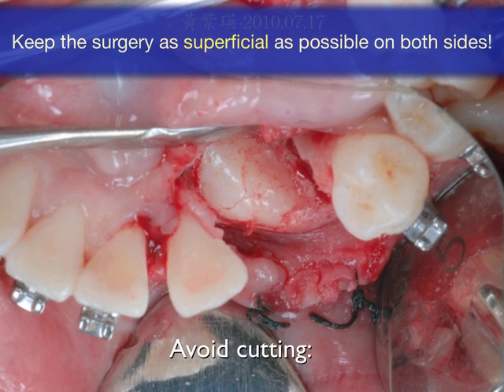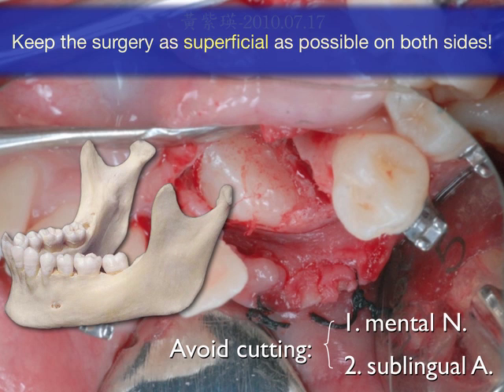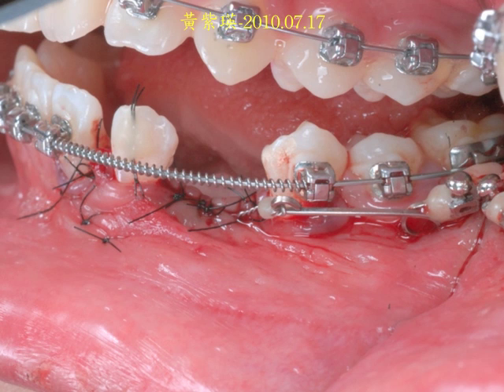So keep the surgery as superficial as possible on both sides to avoid cutting, number one, the mental nerve. Number two, the sublingual artery. It's a big deal if you cut it. Look at the mental foramen right here. If you have any horizontal incision, you will cut the mental foramen. So it's very risky right here. No vertical incision. So I make a superficial operation and put a button right here.